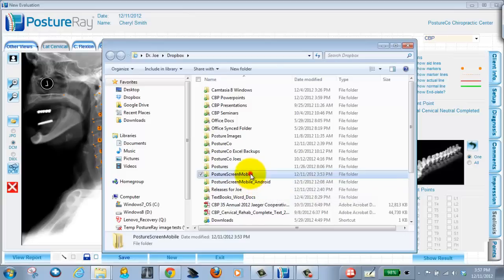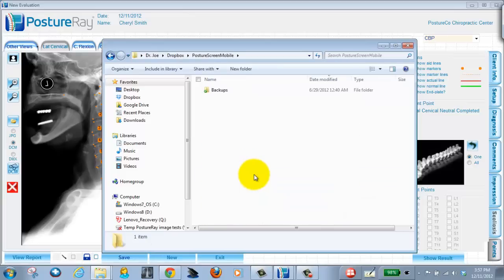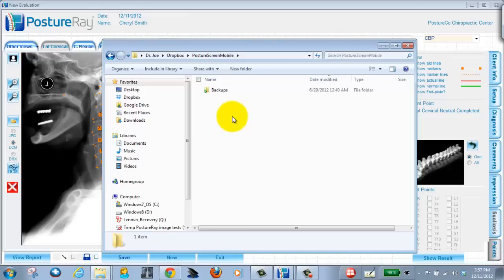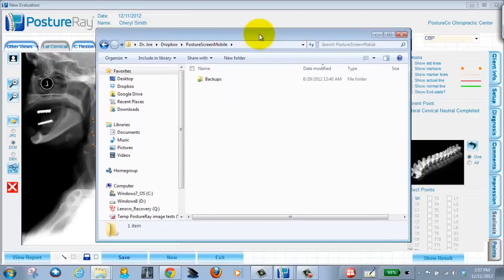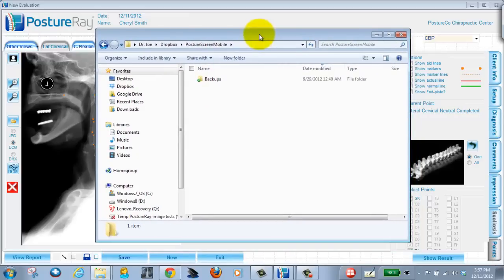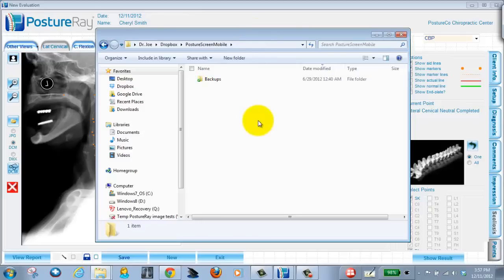Okay, I'm going to go into this folder here. As you can see, I've already pushed a backup and as we push things to our Dropbox it will set up folders. So at first, by just setting up the Dropbox, you won't have a Posture Screen Mobile folder in there. But after you push your reports and your images or your backups, in this case, you will get folders that are created and I want to show you this in real time.